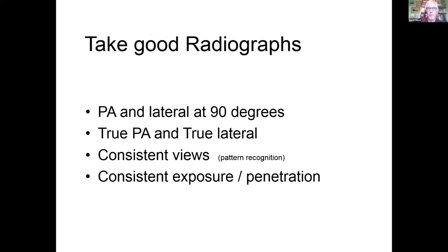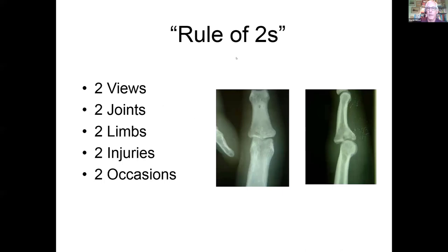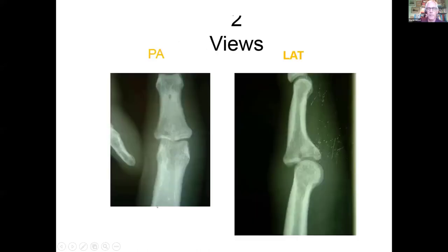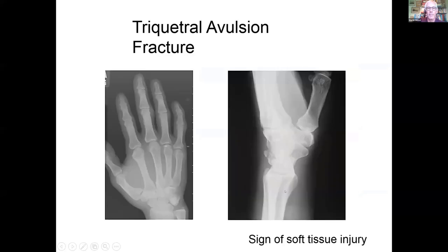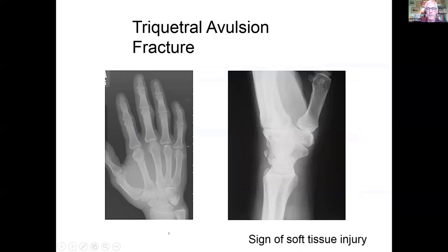To recognise these things, you need good radiographs — radiographs that are consistent. Most x-rays are actually PA and a lateral 90 degrees; these need to be accurate, otherwise you get oblique views which are just harder to interpret. Someone came up with a rule of twos: always have two views, two joints above and below the bit you're interested in; if uncertain, two limbs — x-ray the other side; beware of two injuries; if not sure, repeat the x-ray. Everyone will stare at a nasty-looking wrist fracture — did you all spot the scaphoid fracture? X-rays can also tell us things about soft tissues. A little flake of the triquetrum isn't much of an issue in itself, but it's actually an indicator of quite a significant soft tissue injury — a wrist capsule sprain — and that's the injury that will cause the patient trouble.